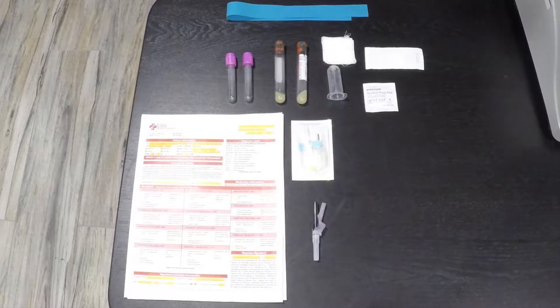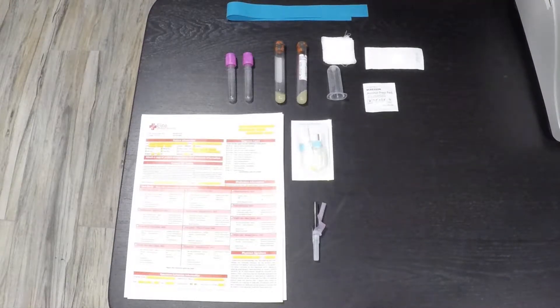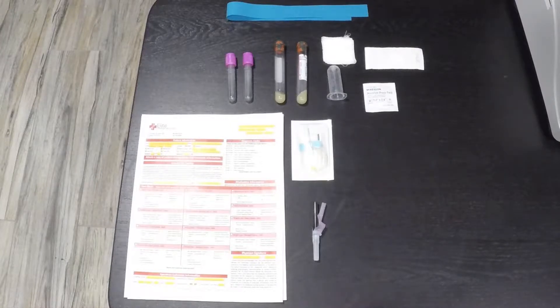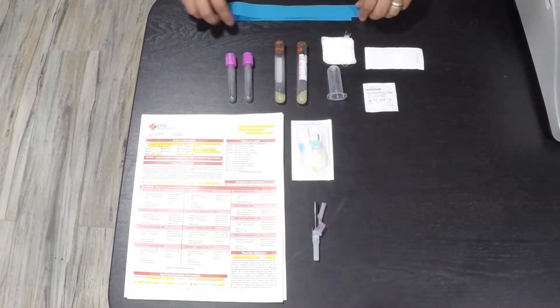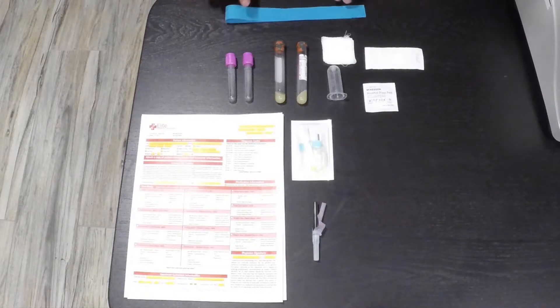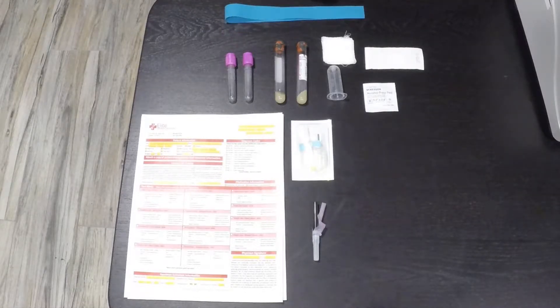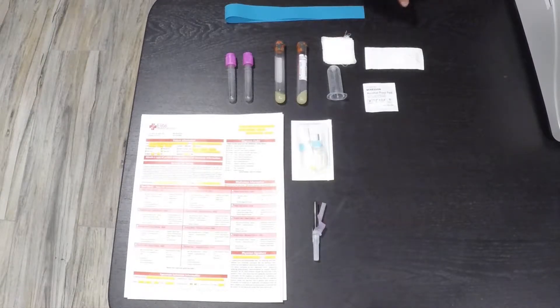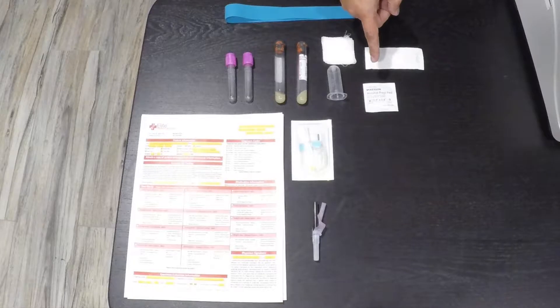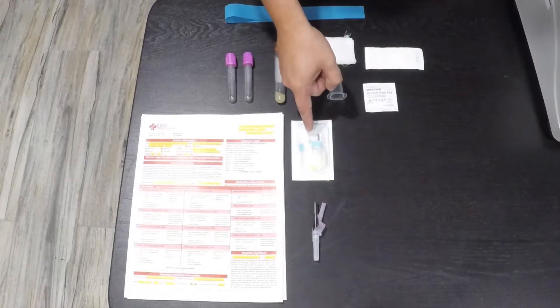Now we will be going over the blood wellness collection process. First, a short summary of the supplies the MA will need: a tourniquet, 2 lavender tops, 2 tiger tops, gauze, a band-aid, an alcohol swab, and a vacutainer for the butterfly needle or the straight needle.